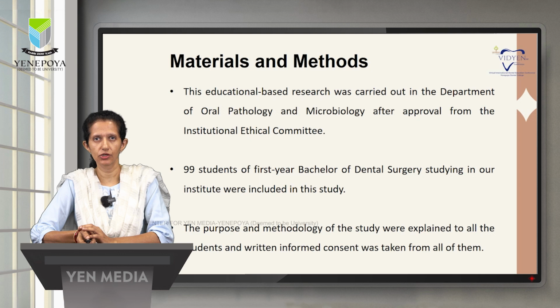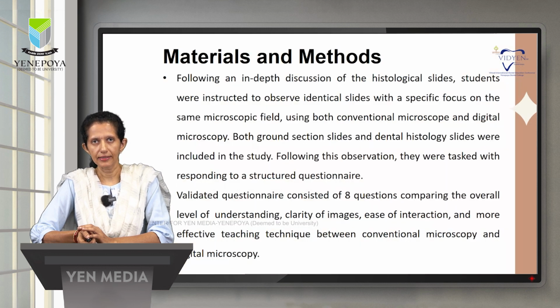This educational based research was carried out in the Department of Oral Pathology and Microbiology after approval from the Institutional Ethical Committee. 99 students of first year Bachelor of Dental Surgery studying in our institute were included in this study. The purpose and methodology of the study were explained to all the students, and written informed consent was taken from all of them. Following an in-depth discussion of the histological slides, students were instructed to observe the identical slides with a specific focus on the same microscopic field using both the conventional microscope and the digital microscope.